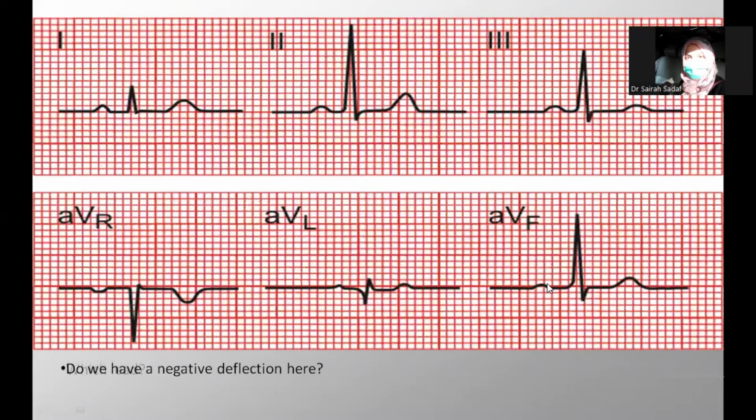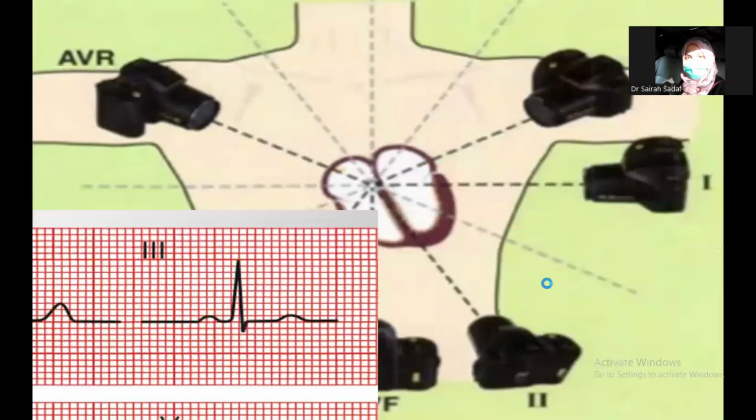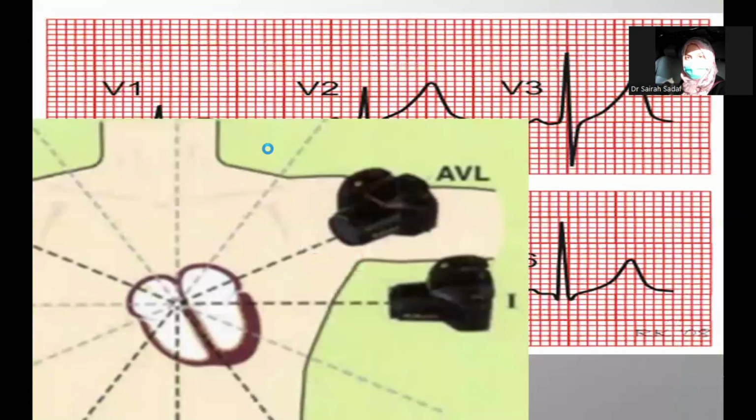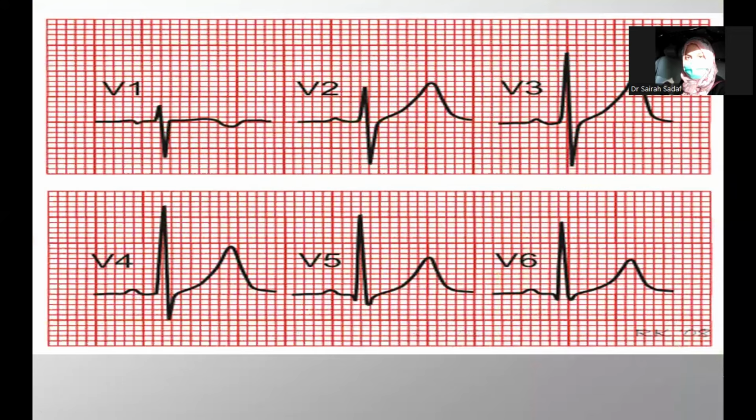Now about the, yes, that is just for reinforcement, this one. Just to tell you again where the electrodes are placed and all that. Now about the precordial leads. Let me see the chat box. Negative because it is actually going opposite. Yes, Sahid, you're right.